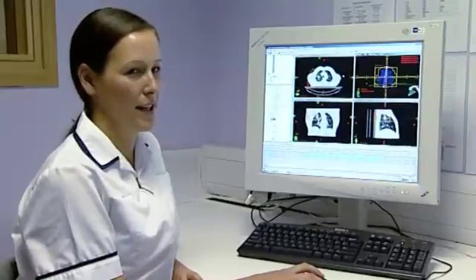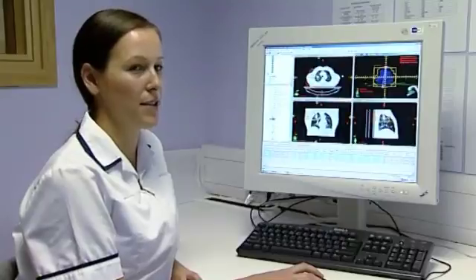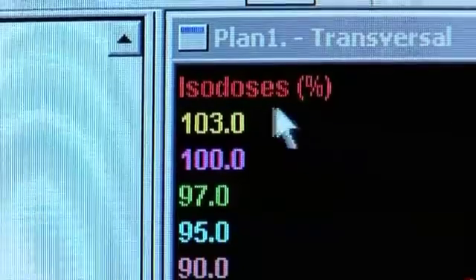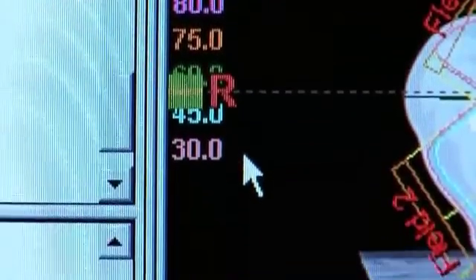So now we need to calculate the dose distribution and normalize the plan to the isocenter. The isodose lines all represent different percentages of the dose according to their color.